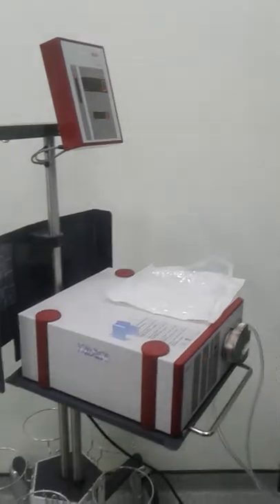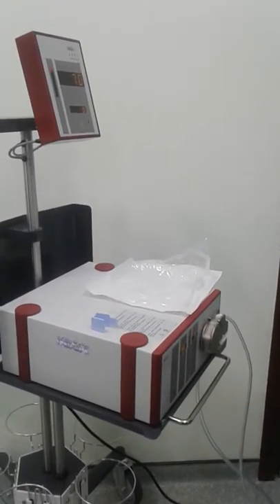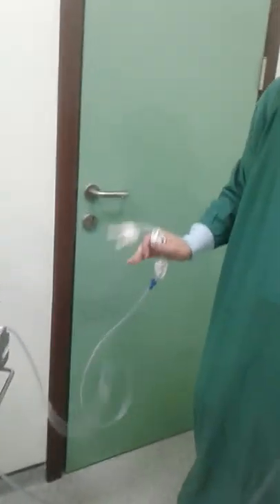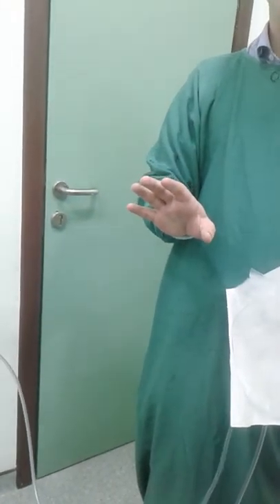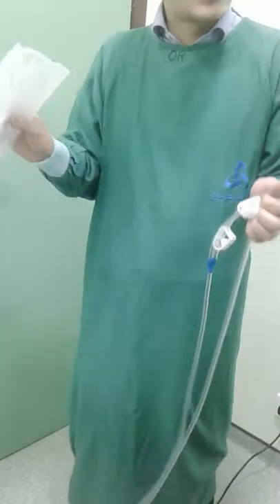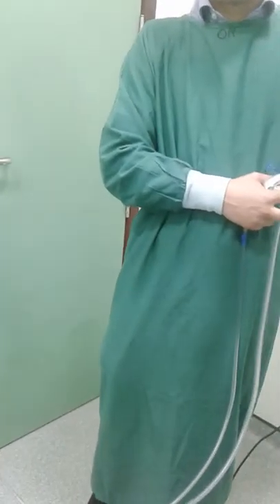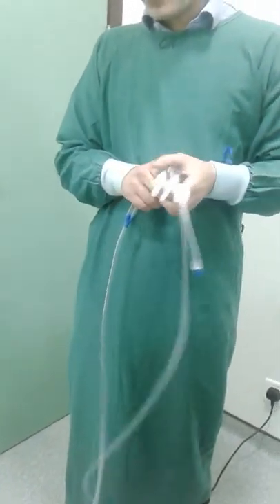Now you have also connected this. So next time, will we be able to use this again? No, this is a single use only. It is already connected and sterile. You just remove the bag and use it. No need to sterilize. Now you connected this, so it means that it has been used. Only a single time you can use it. All disposable. Richard Wolf.